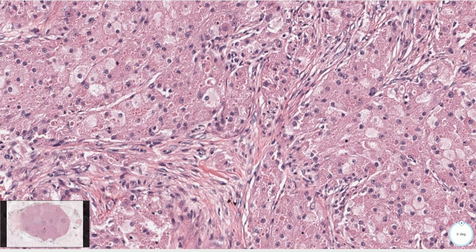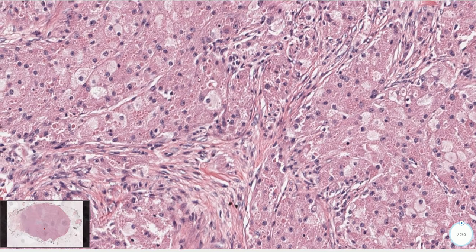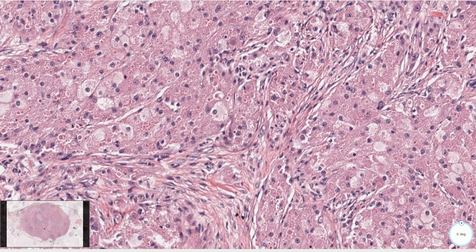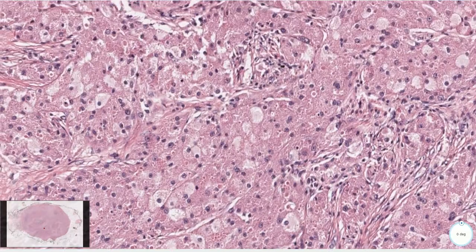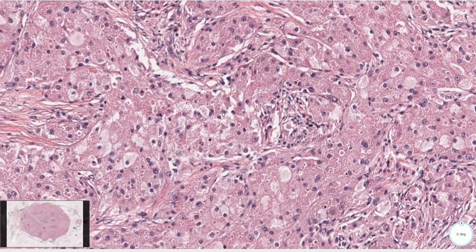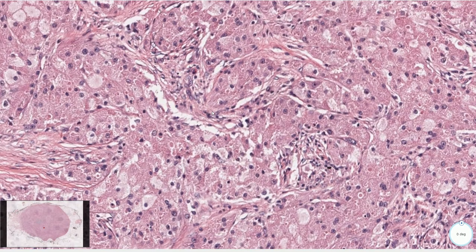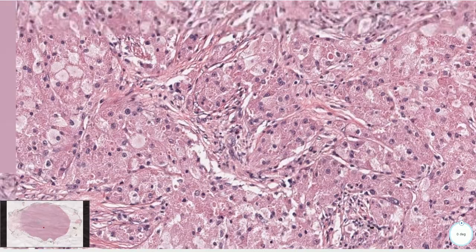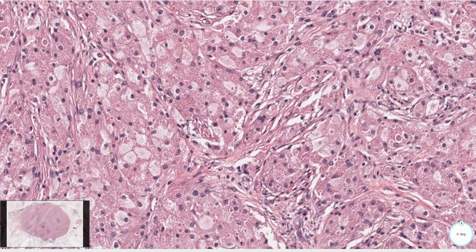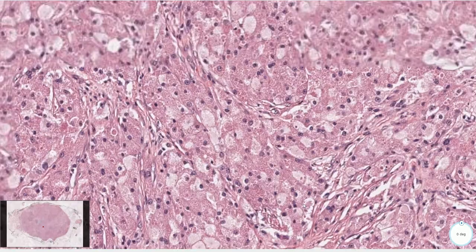Most granular cell tumors are benign and only rare cases are associated with malignant behavior. These tumors may resemble malignancy radiologically and also on gross examination.